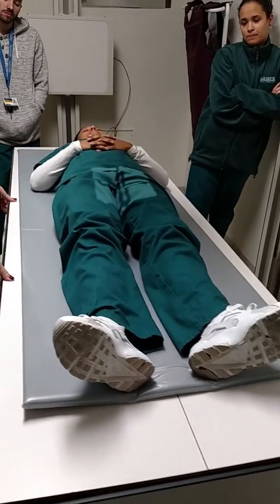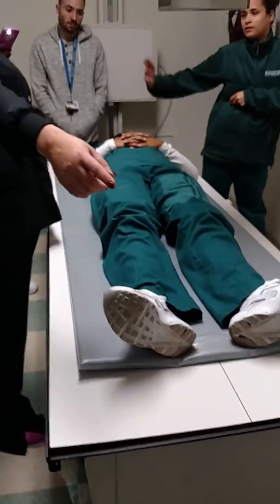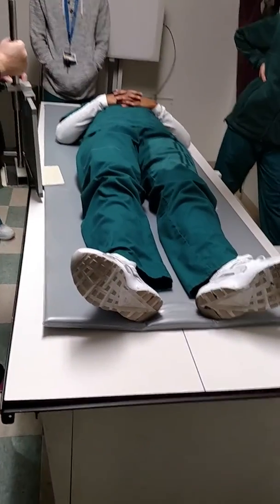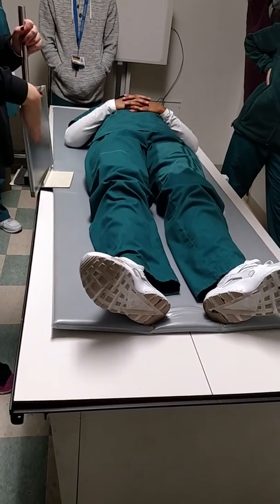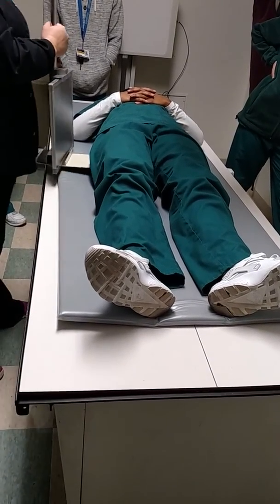So then we're going to do a funny one. So standing table straight all the way, as far as you can get it because you know you're going to be working over there. All right, now you have to use a 10 by 12 for this. We do not have a 10 by 12 grid cap. So if you pull this one, you have to put this in here and look at me and go, grid cap, grid cap. So I know you know there's a grid cap.